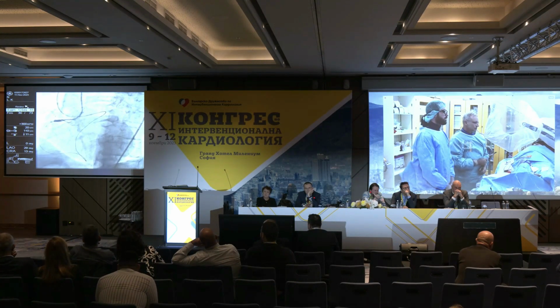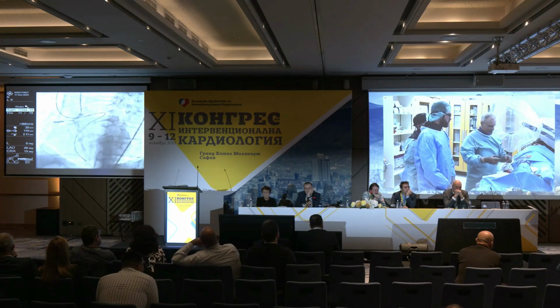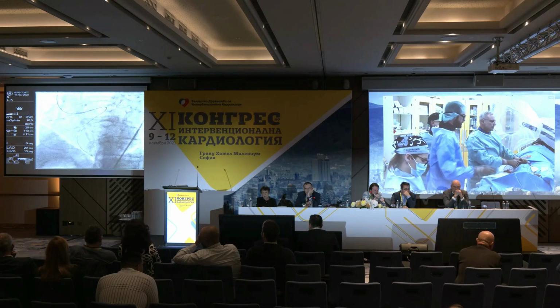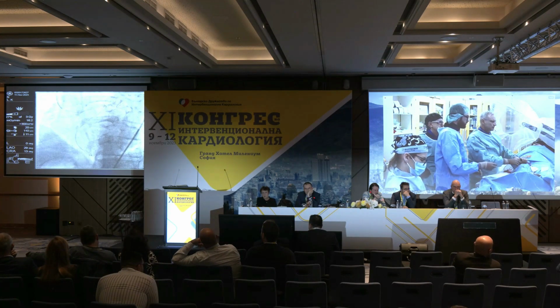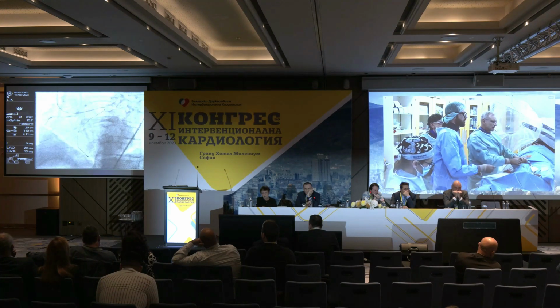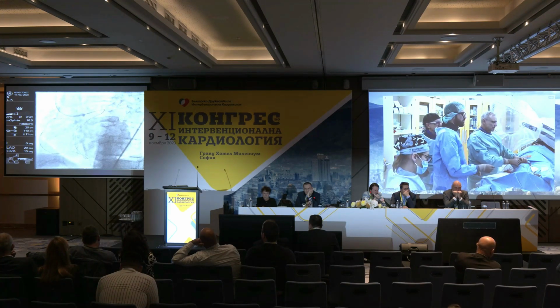Anyway, it looks like the microcatheter is going in the right direction. So give me the run-through wire. I will remove this wire anymore, I don't want it. No, it goes okay. So I'm pushing in and out. It goes okay. What does that mean?